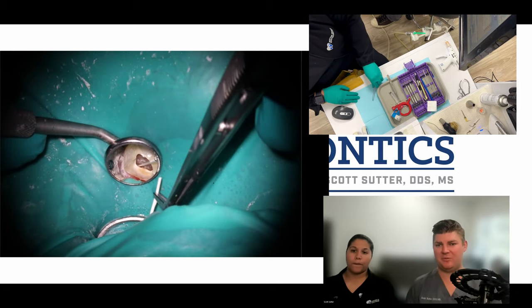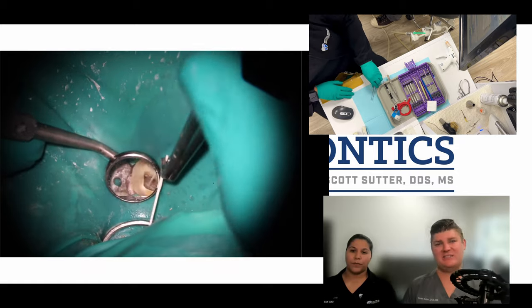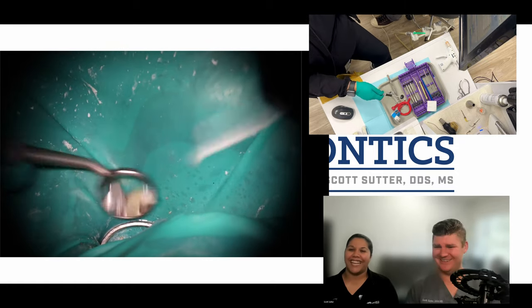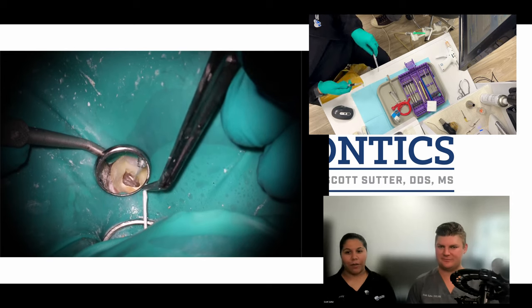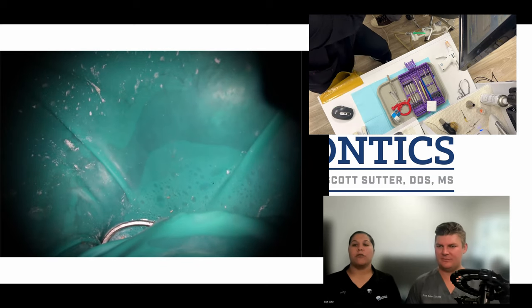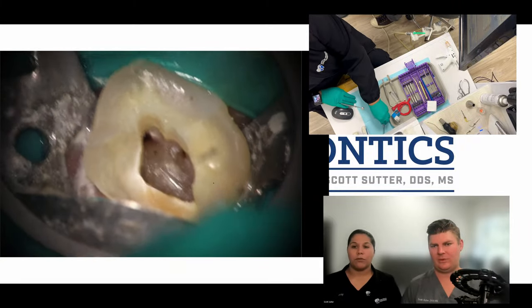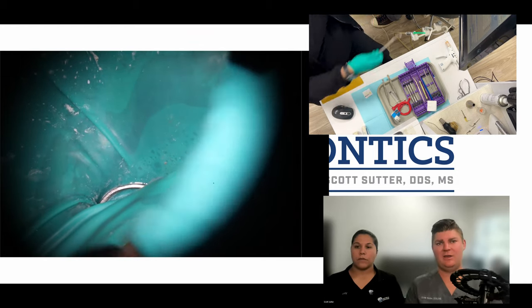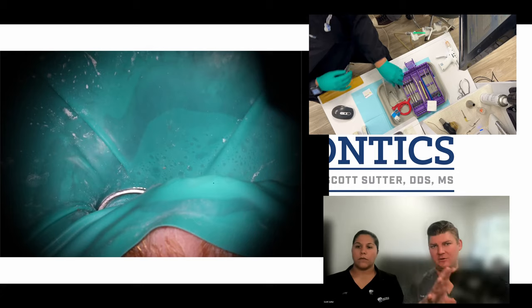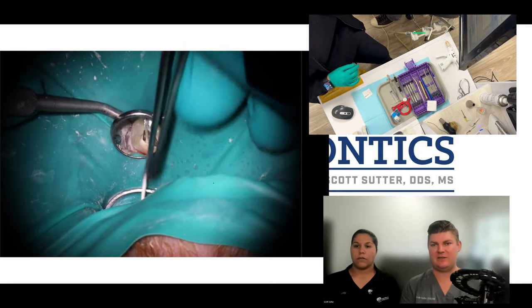You can see that double distal there — they join right up, so it doesn't look that cool on the final x-ray, but I could technically say there were five canals. I'm also throwing away the paper points, which helps with cleanup at the end. I grabbed the photo mirror and a couple of paper points back because I'm counting and I know he's going to say that's it — and then need a picture. When you have it set up properly, you press the spacebar and it goes right into the software. It's a very nice system.